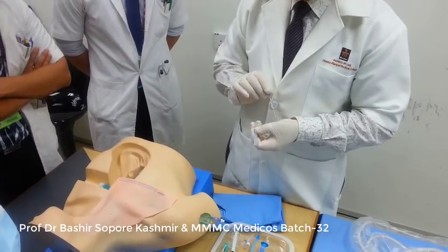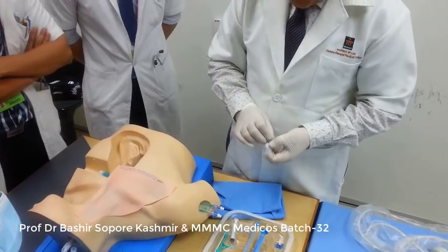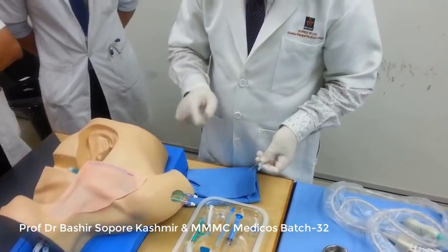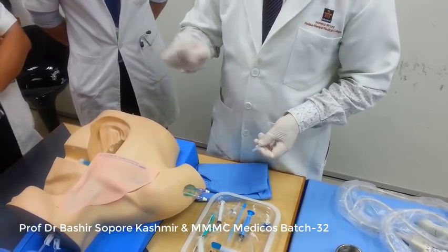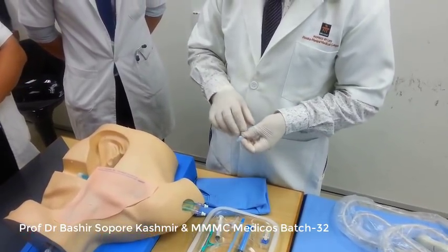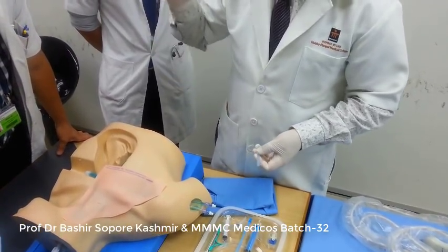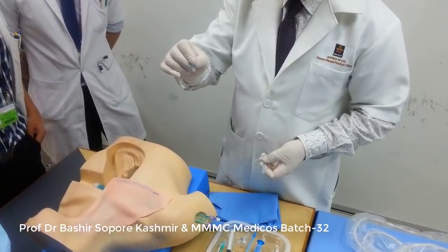And this introducer needle we can advance alongside the needle finder, or put parallel to the needle finder, so that we can easily advance it into the internal jugular vein.